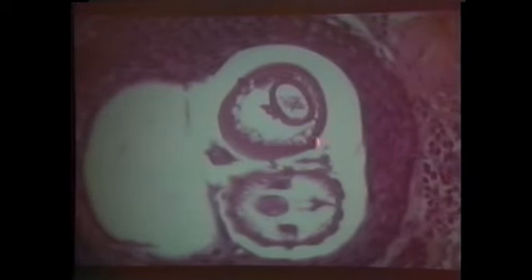And sometimes, look at this. This is cuticle right here. Look at this real thick cuticle. Here we go, a reddish cuticle, and it's not pointed or whatever, but that is an internal cuticular ridge. Sometimes there are lateral alae, and some worms have plaques on them, bosses, if you will. This is Gongylonema. It's the only one that has that.